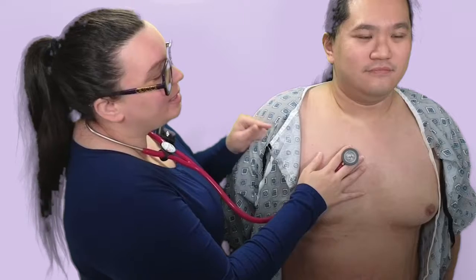In this specific location, we're going to hear the dub sound — the S2 — much more pronounced. The reason the S2 sound is louder is that it corresponds with the closure of our semilunar valves, which are our aortic and pulmonic valves. This happens at the end of systole, the phase of the heart cycle when it contracts and pumps blood out of its chambers.